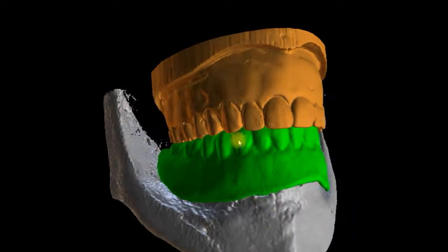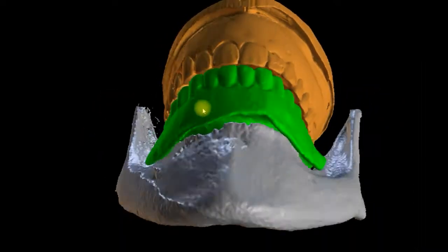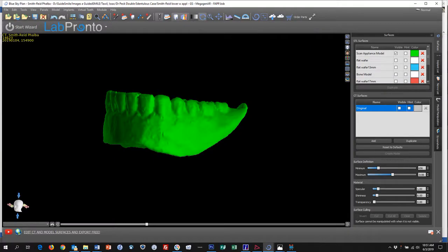Once the scan appliances or the dentures are confirmed to fit 100% and the doctor is happy with the tooth position, then a dual scan technique is performed. This is following the traditional Nobel dual scan protocol, which is scanning the appliance, or in this case, appliances, seated in the mouth, fully, with no rock, in occlusion. You do not want anything to separate the upper and lower arches. You want the teeth to come together. That's the first scan. Then scan the appliances alone individually.